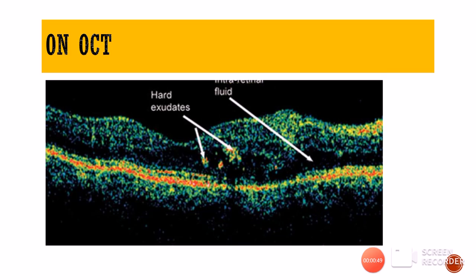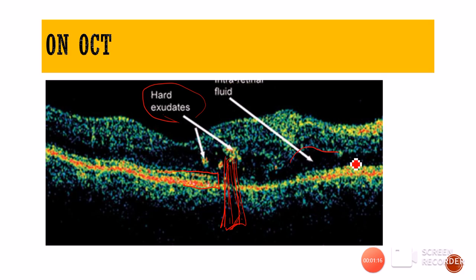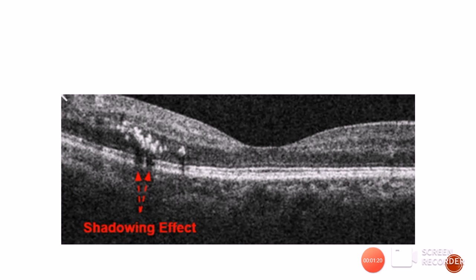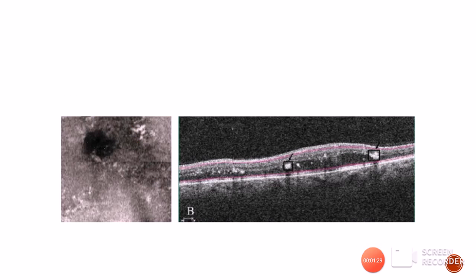On OCT, hard exudates in the outer plexiform layer absorb light and produce a shadowing effect. Layers of the retina are visible in unaffected areas, but behind hard exudates the layers cannot be seen due to shadowing. Hard exudates are also associated with surrounding fluid, appearing as hypo-reflective areas on OCT. The clumps of hard exudates show these characteristic hypo-reflective shadow bands behind them.